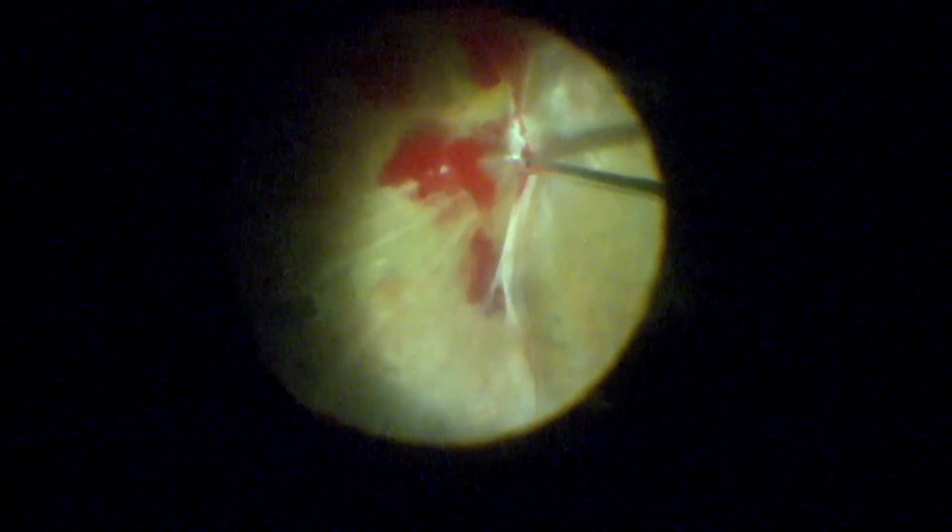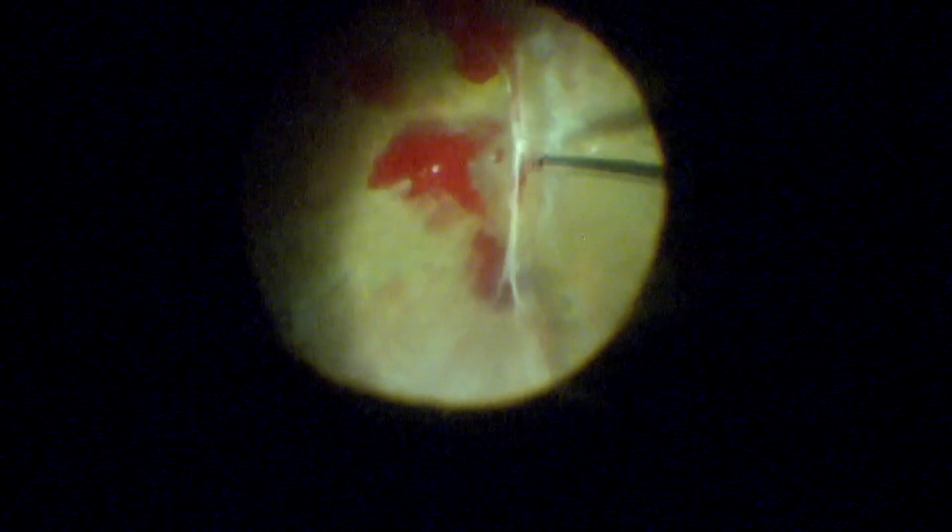So majority of work is just blunt dissection, and you just have to cut those small points of attachment that is present between the fibrovascular tissue and the retina. Here I am using the scissors to help in the dissection, but you would see a majority of work is generally with blunt dissection.